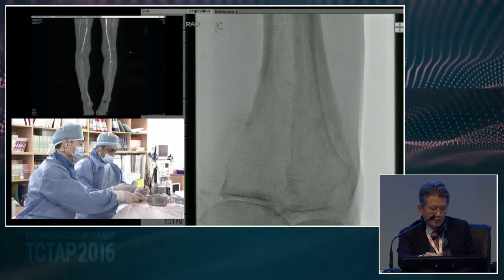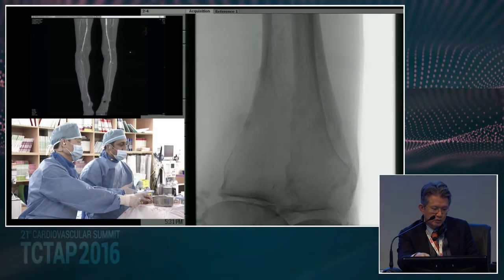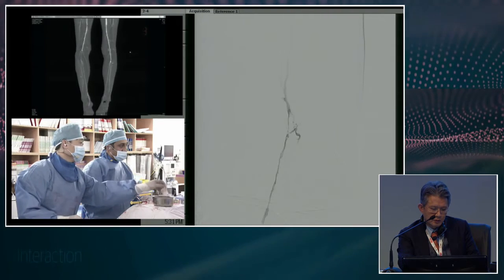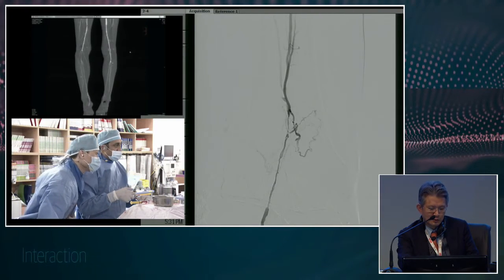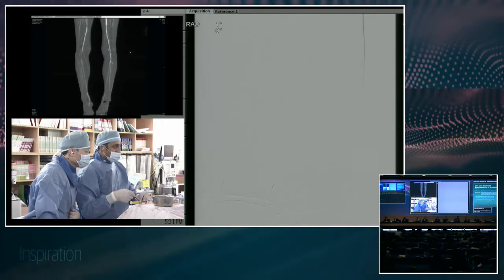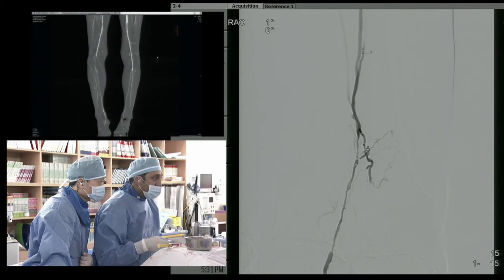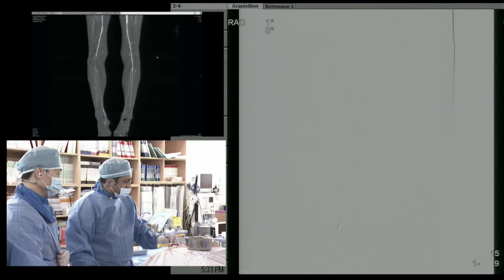To try over, why does it not go directly to the true lumen? It goes out the collateral or subintimal space. So, yeah. Well, there's clearly a fenestration there. Maybe the angled view is much easier to understand where it's dissecting. Yeah. I think a different angle here would be better, I agree. We've gone through a few angles already. We'll go a little bit steeper now.